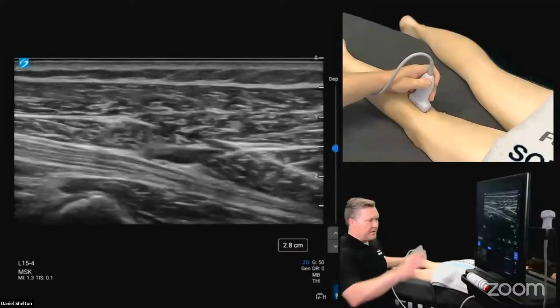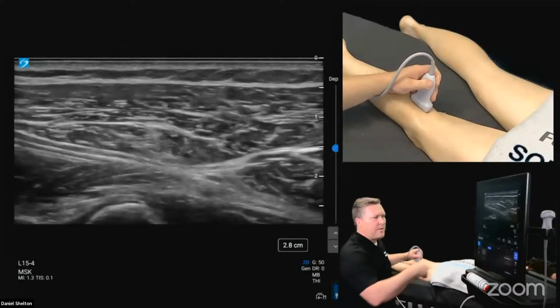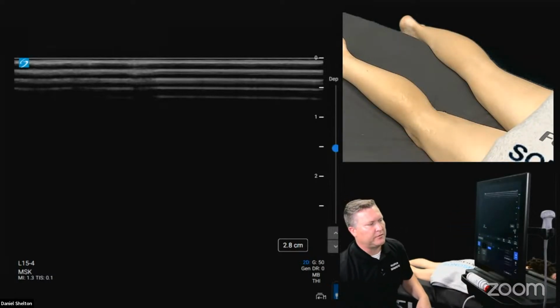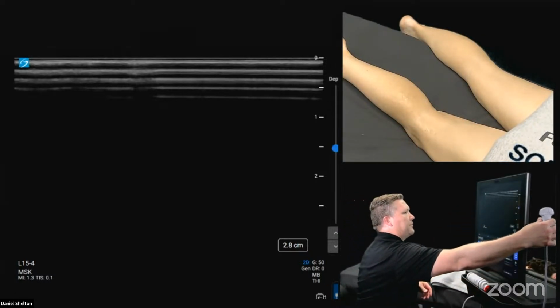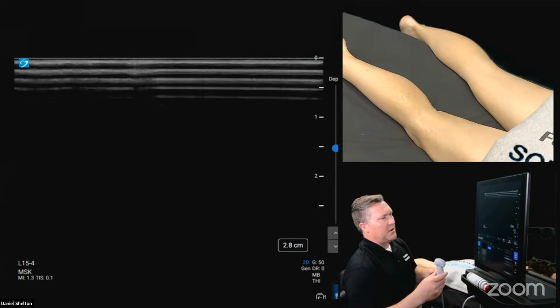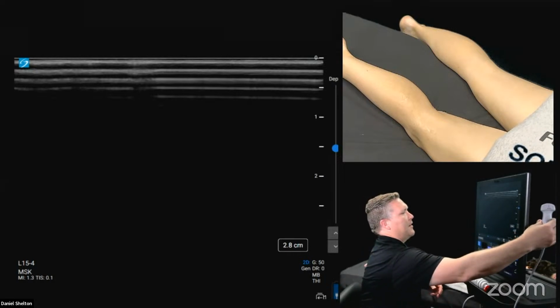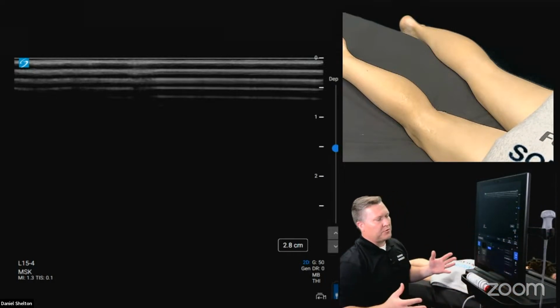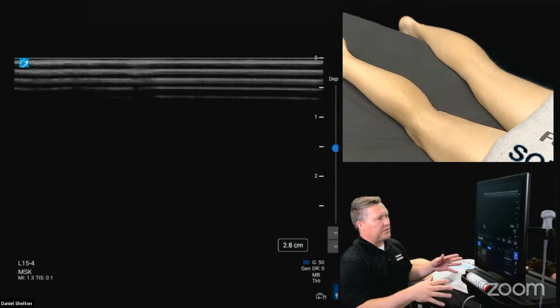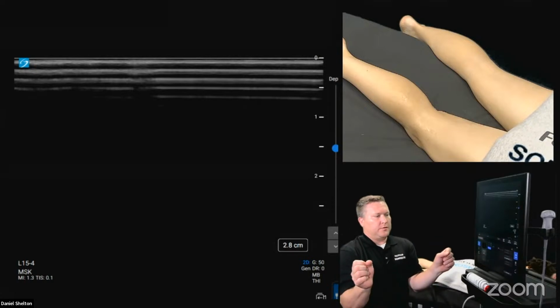So it's just the cleanliness of the machine I like. I think you can see the transducer holder. On the back, they have these really cool arms. A lot of people are solo artists when they're doing their procedures, and you have to figure out how to cover a transducer yourself. So I like that we put these little arms on the back of the ST, and it allows you to stand behind the machine away from the procedure site. There's a tray on the back, which is not super visible on the video, but you can set your procedure supplies up back there, and it acts like a tray table and two arms holding the transducer for you.